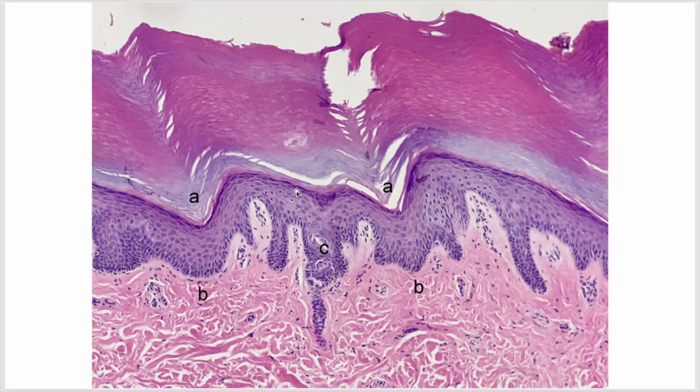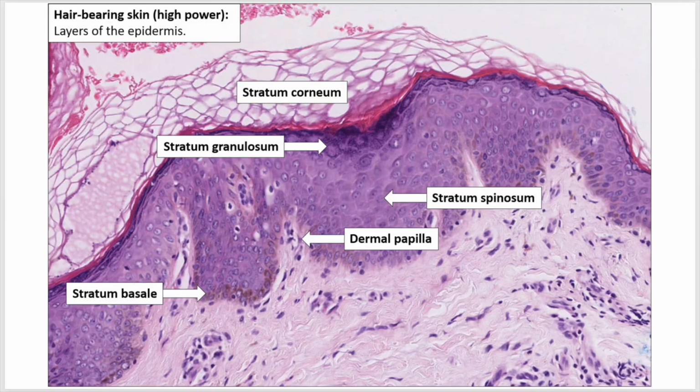Those are the features of acral skin. And let's talk about those layers in detail. We have talked about the stratum corneum. In non-acral skin, the stratum corneum usually looks very basket weave or loose. And below that, there shouldn't be any stratum lucidum on the non-acral skin.